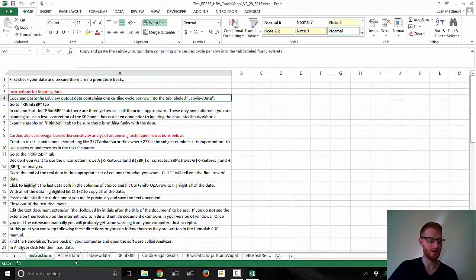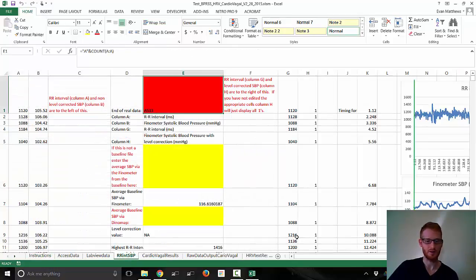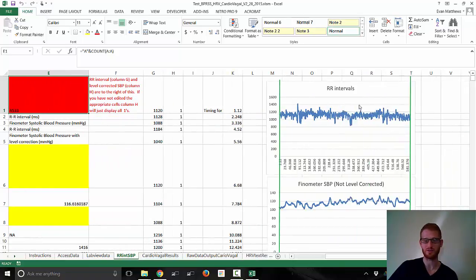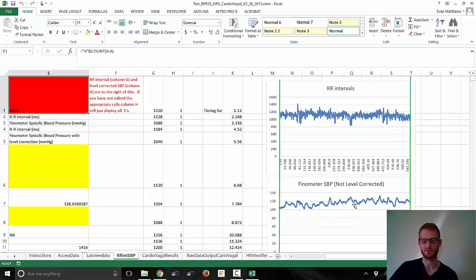The data is in here and it's being read. Let's go back to the instructions tab — it's going to tell you to go to the R-R interval to systolic blood pressure tab and see if everything looks the way it should. We have some graphs here: this is R-R interval being graphed, and this is systolic blood pressure being graphed — that's basically what it would typically look like. As long as there aren't any weird shifts or large spikes, you're probably good. This is pretty typical.